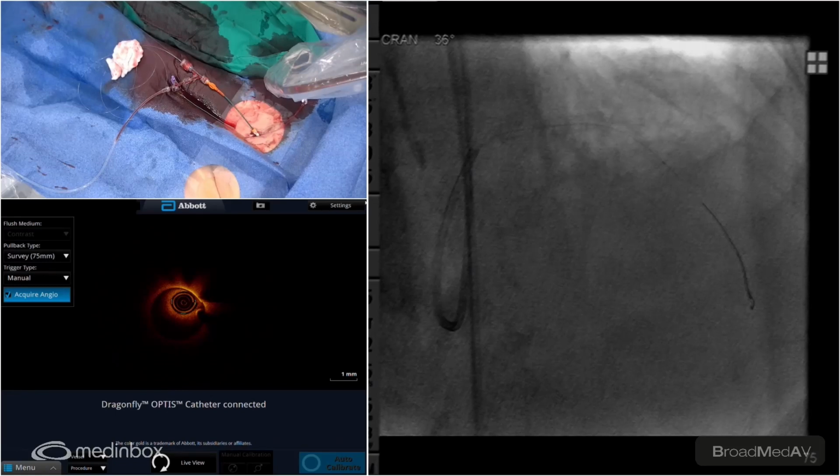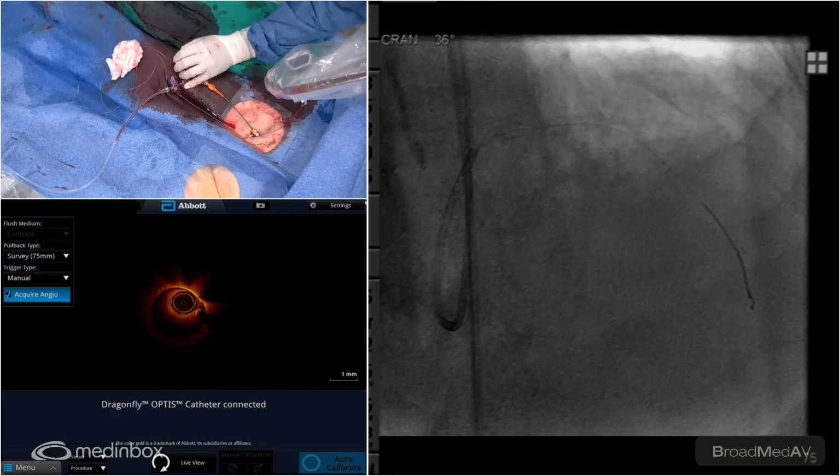How's our ACT team? Perfect. Okay, let's try the guide liner. Yeah, let's get this back on there, Arjun, after he's got control of the guide liner. Perfect. I got it.